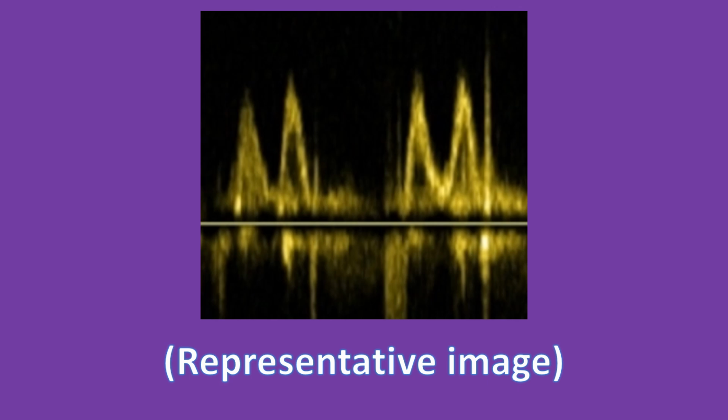Right ventricular diastolic function can be evaluated from the tricuspid inflow pattern by Doppler interrogation. Right ventricle can be an open system in diastole with antegrade forward flow into the pulmonary artery during atrial systole. During Doppler evaluation of right ventricle, the 5 to 10% increase in the measurements with inspiration has to be considered. This is applicable to pulmonary artery systolic velocity, right ventricular gradient, tricuspid regurgitation velocity, and tricuspid inflow Doppler. This may lead to inability to detect small changes in status of the right ventricle.